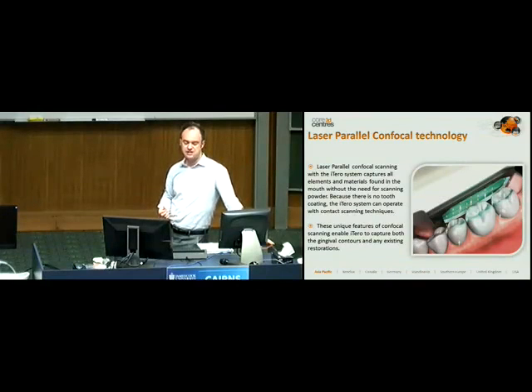So what it picks up is an extremely accurate and clean image where it's able to build the three-dimensional image, if you like, or a set of images. So when you see the demonstration later, you'll notice that every time I want to take a shot, I'm effectively holding the camera steady. But as much as it looks like a static snapshot, like an SLR camera, it's actually doing a very complex thing. It's recording a video feed in and around that particular area.